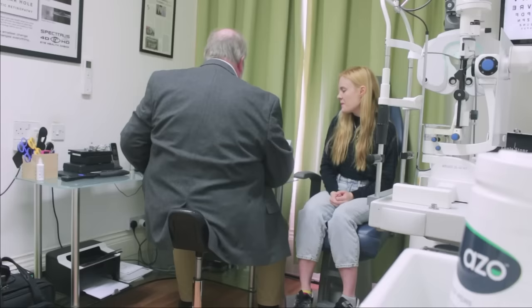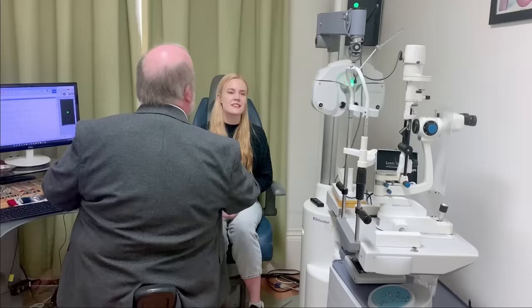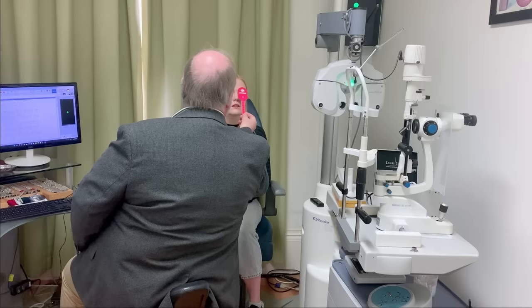So, on my letter chart out in the mirror again, on the third line up, let's not go to the third line up because you're going to have a struggle with that one, aren't you? Let's try my dot. Can you see my green dot there? Yes. Okay. So keep looking at my dot. I'm just going to cover each eye, okay? And this might make the dot hop around a little bit. Does the dot hop or is it staying still? It moves. Is it going up and down or side to side? Side to side. Okay.